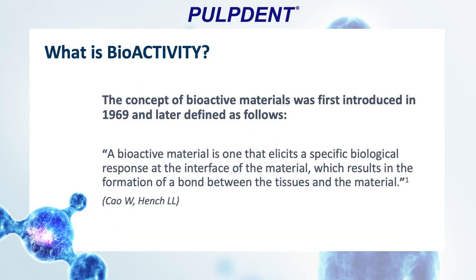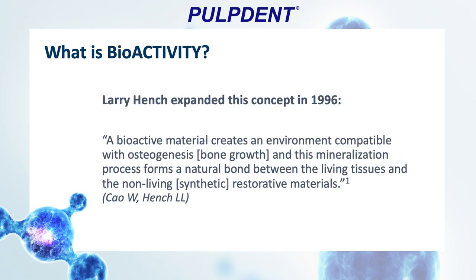So what is bioactivity? The concept of bioactive materials was first introduced in 1969 and later defined as follows. A bioactive material is one that elicits a specific biologic response at the interface of the material, which then results in the formation of a bond between the tissues and the material. In 1996, Larry Hench expanded on this concept. A bioactive material creates an environment compatible with osteogenesis or bone growth, and this mineralization process forms a natural bond between the living tissues and the non-living synthetic restorative materials.